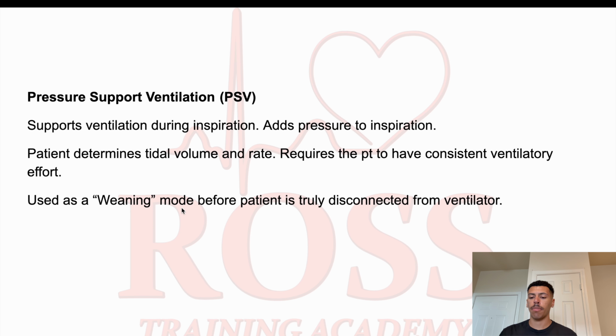And so this is going to be somebody who's been on the ventilator for weeks, months at a time, and now they're going to be spontaneously breathing. We're going to put them on this just to assist, just to strengthen up those lungs, and then take it off, monitor, and then hopefully discharge is going to be what's happening soon.